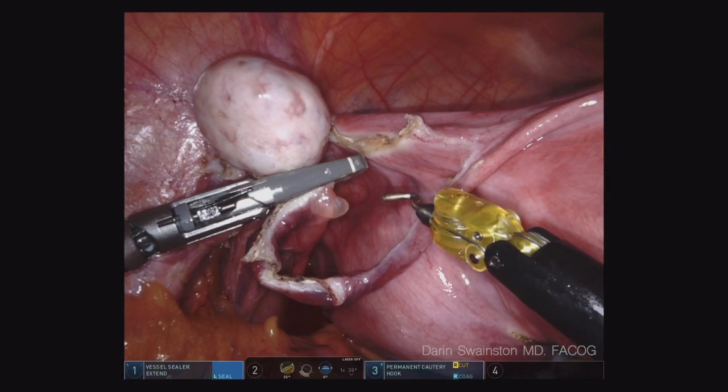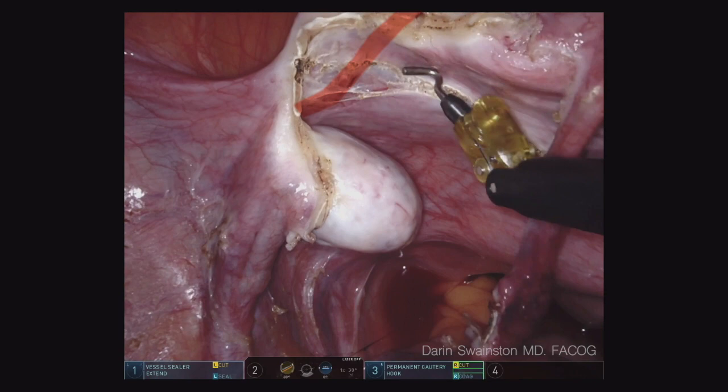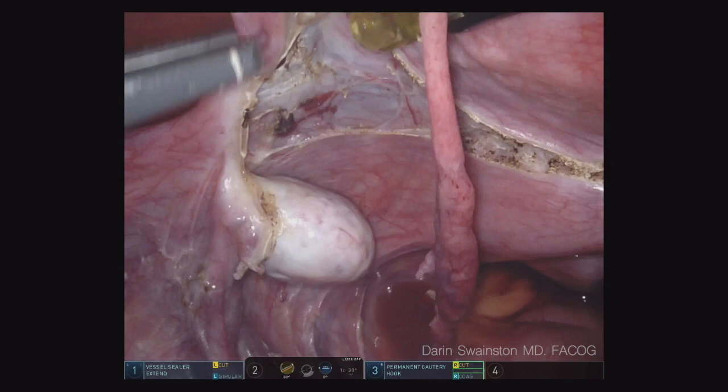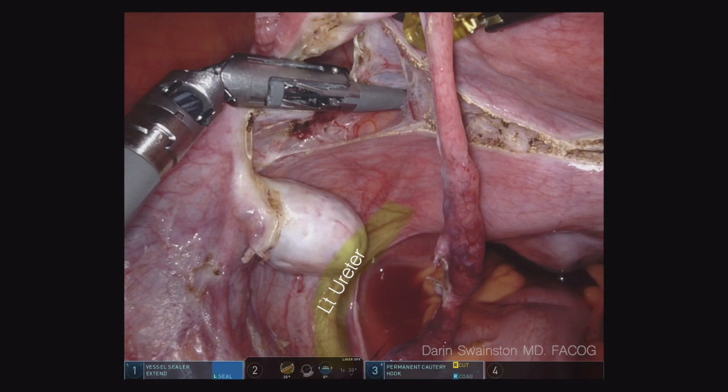Clear down anterior and posterior broad ligament on both sides. We're going to finish that incision. You can see there's a little vessel that runs right underneath the round ligament — we want that window there. I actually nick that little vessel a little too much. It doesn't bleed very much. But you want really the window where you can see that little gray round circle, and I go a little lateral to that. I use the vessel sealer to take that to avoid any bleeding. You can really see how efficiently you can dissect that broad ligament out by having that hook pulling up and medial and keeping that round ligament intact until the very last minute.